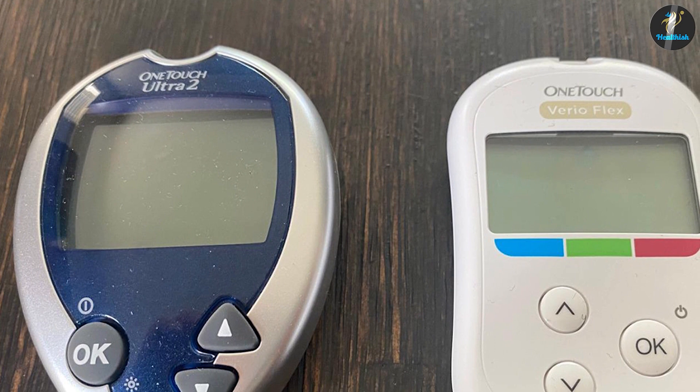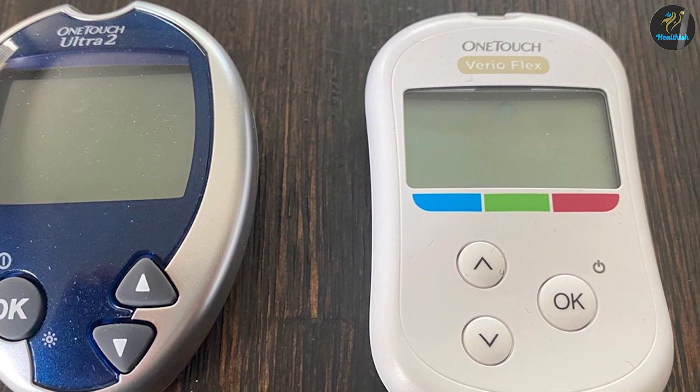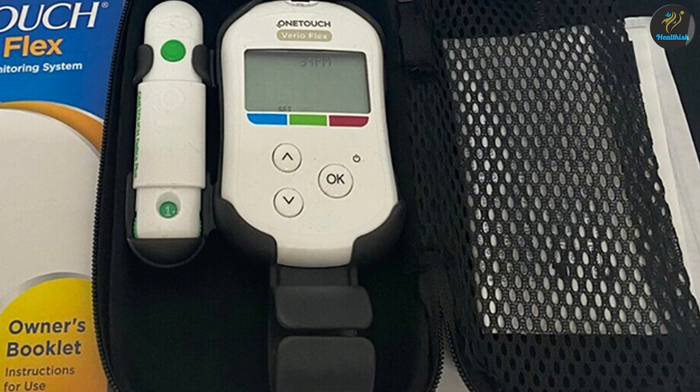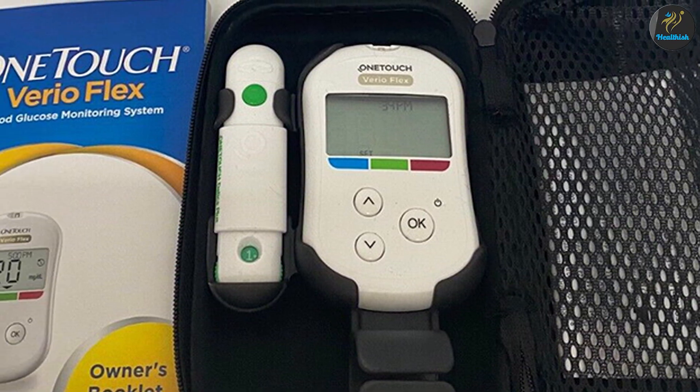The ability to share data is a top feature, making it super simple to give readings or reports to friends, family, or medical professionals. We also like the ability to set reminders so you take your insulin on time. It's a superb app, only bettered by the likes of the Contour Next One.